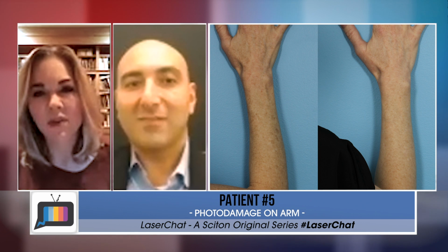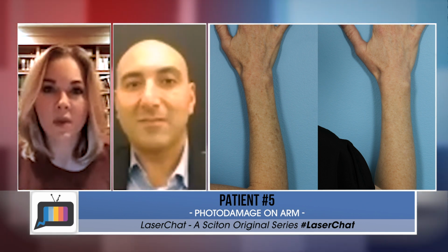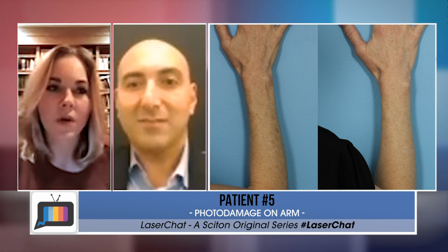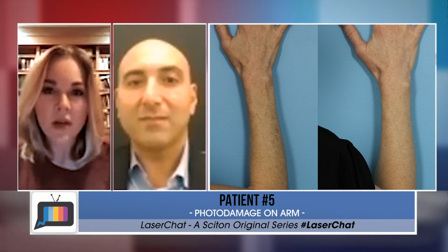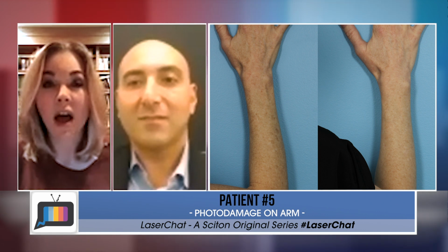And I agree, we have to focus on those macular SKs somehow. We can go in with an erbium, you can go in with a simple electrodesiccation or cryo. But I usually like to clear them out first. So we do the treatment, then we wait 2 to 3 months, come back and see me, and let's see what's left behind.